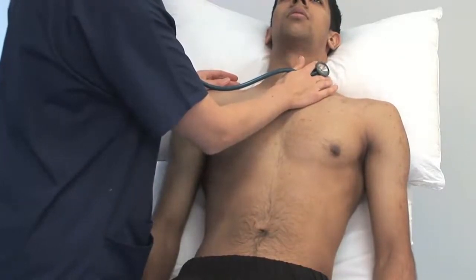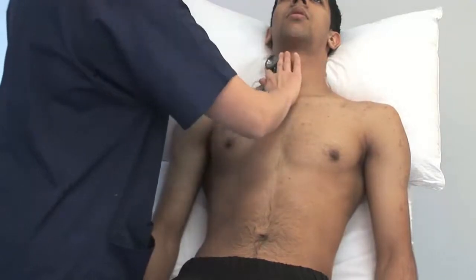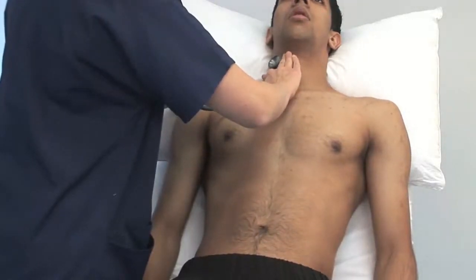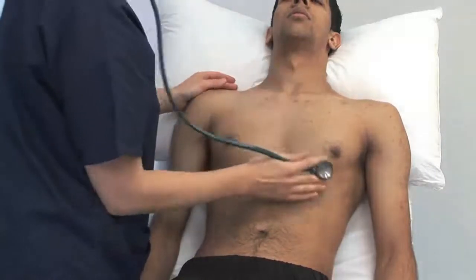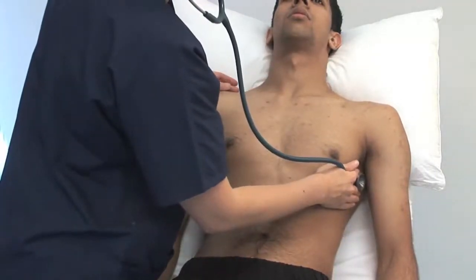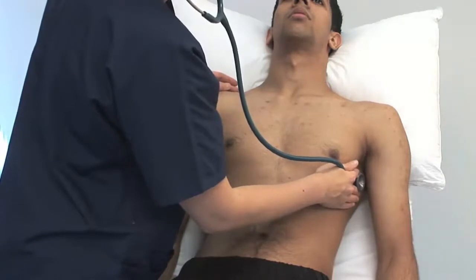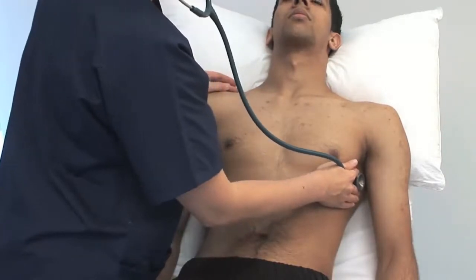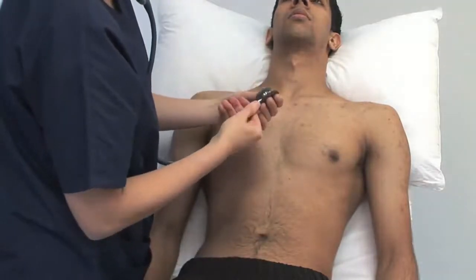Breathe normally. Listen over the carotids with the diaphragm. You may hear the radiation of an aortic stenosis murmur or carotid bruit. Listen in the left axilla with the diaphragm. The pan-systolic murmur of mitral regurgitation, often described as loud and blowing, can radiate here.